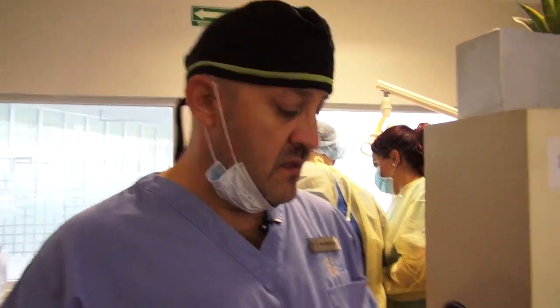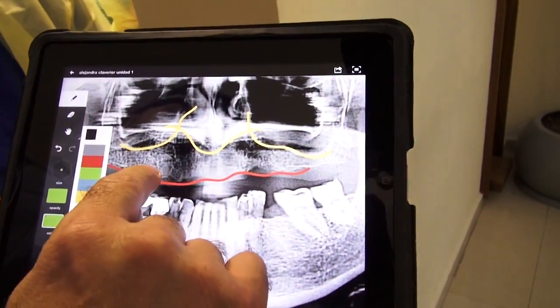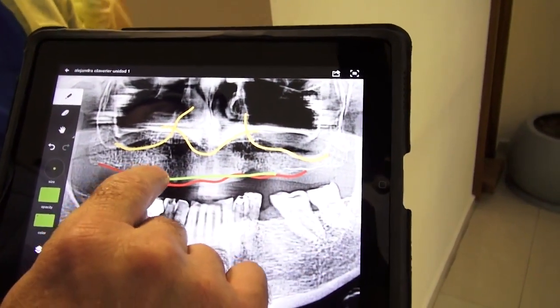The chief complaint of this patient was that she was wearing a denture, and she's very young. She decided to place six implants — she told us she wanted 'all on six,' but the correct term is a screw-retained bar over six implants.